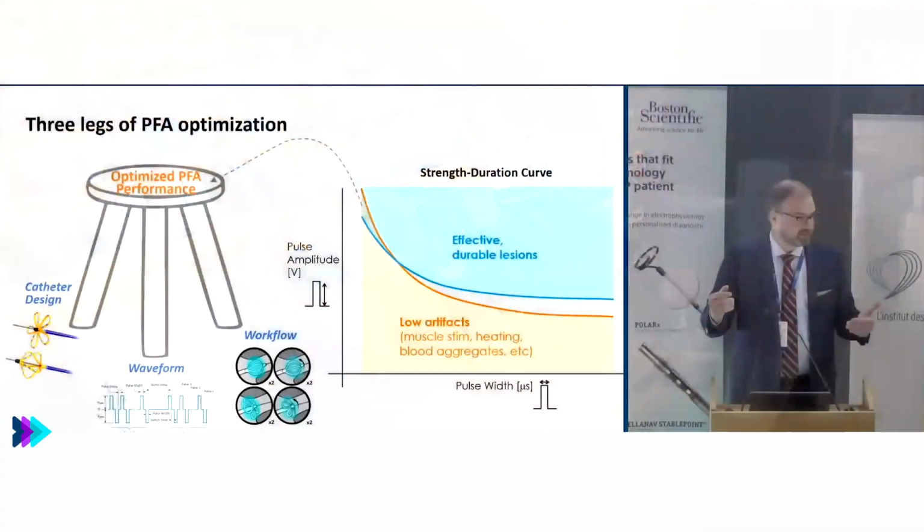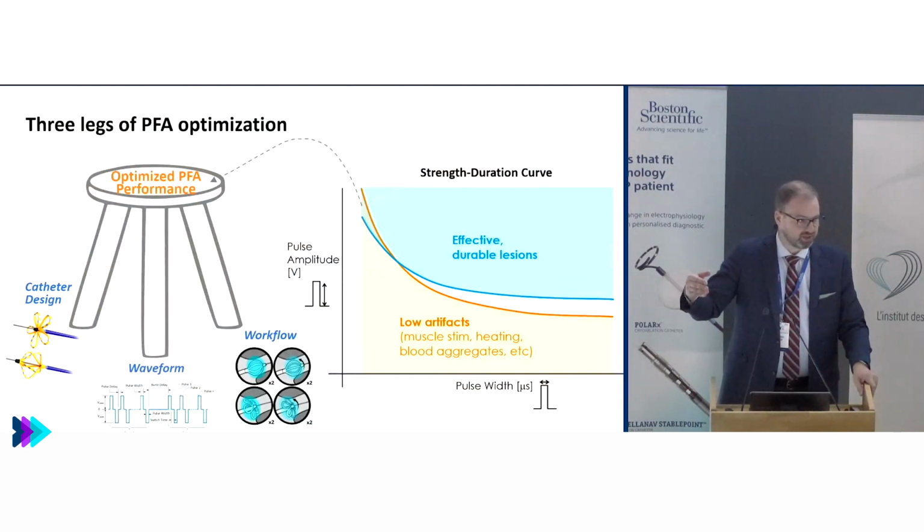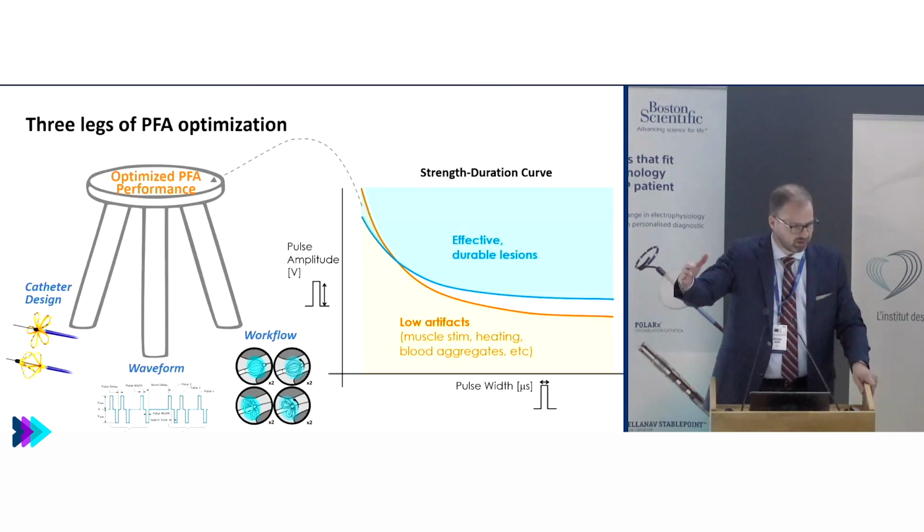And the reason we did that is because some of these other catheters that we see have other requirements, like we want to do high density mapping or something like that. So now you're doing yet another thing that you're trying to do with the same catheter. And so they require different development.